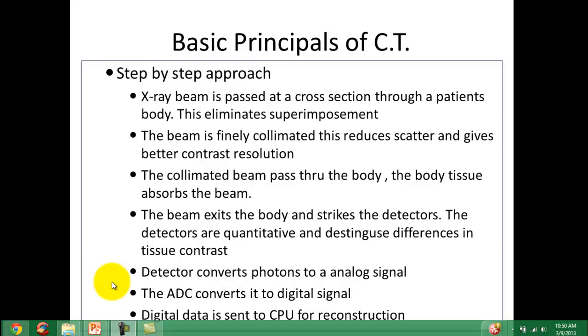This voltage then has to travel and be processed in a computer, but before it gets there, because computers don't work with voltages, it needs to go through what is known as an analog to digital converter, or ADC, which is going to convert our voltages into ones and zeros, basically our machine code or binary code, which our computer can utilize for reconstruction.